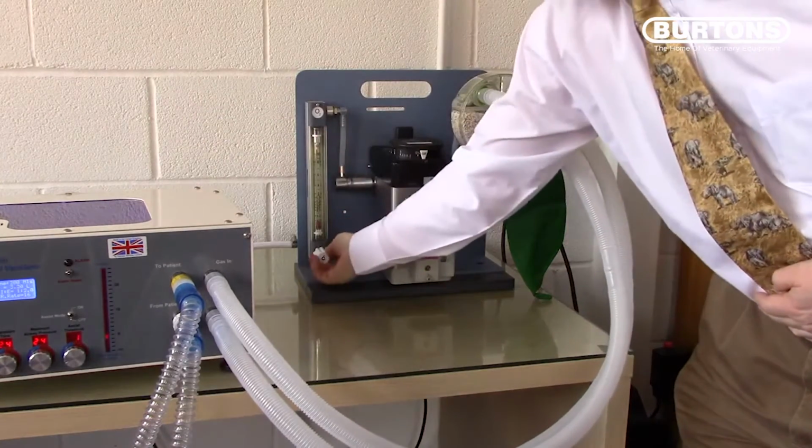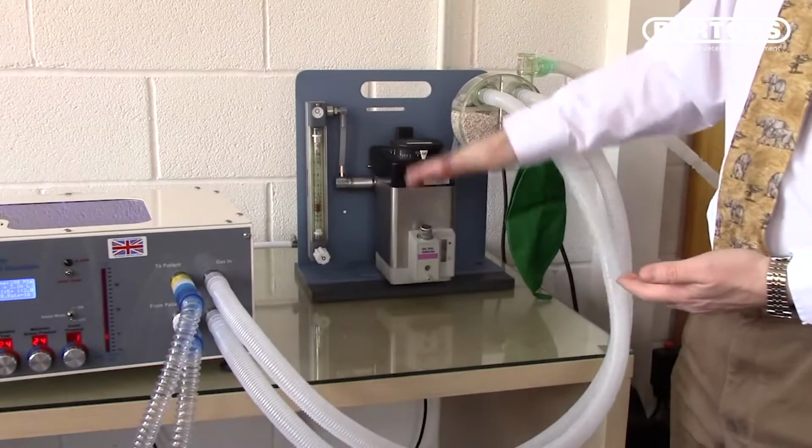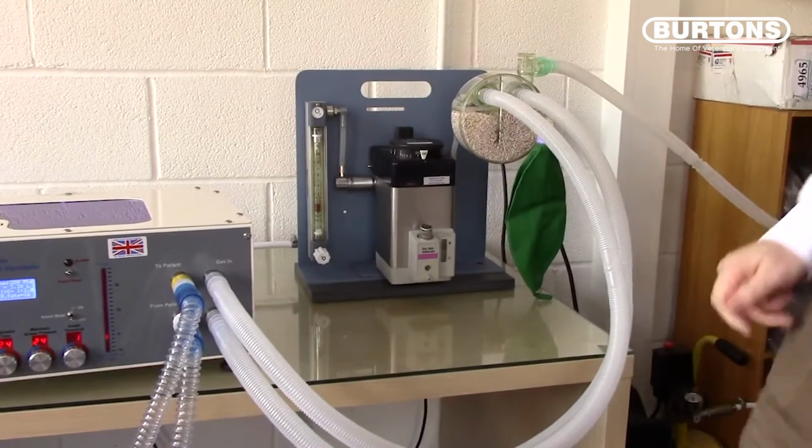Set the fresh gas flow rate on your rotameter or flow meter to at least metabolic requirement, typically higher, and the gas passes through the vaporizer in the normal way. We're now ready for ventilation.